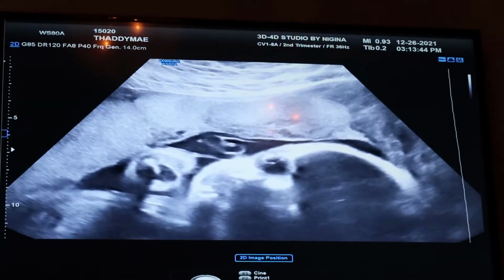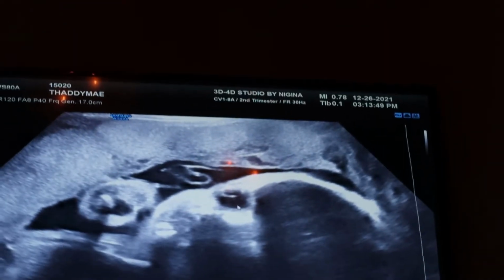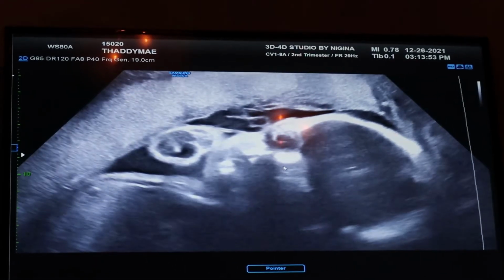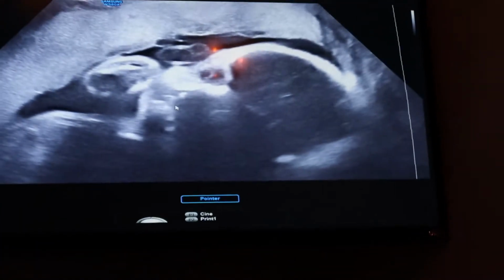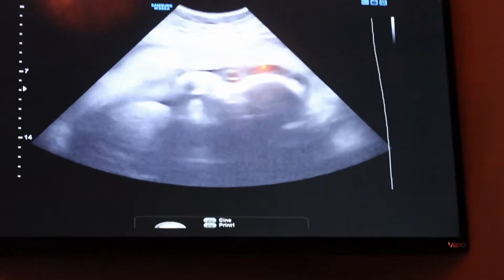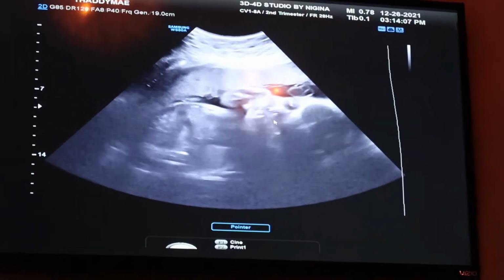Oh my god! Did you just see it? I know it's a little wild, but it's so cool. That's his eyes. And that's his mouth. And the nose, the cheeks, the mouth, the lips. They drink the amniotic fluid and they pee and they practice in there. These are all the healthy signs. That's his heartbeat right here. Do you guys see his little mouth going?